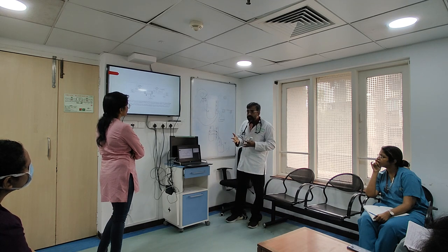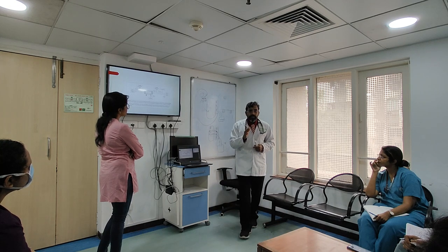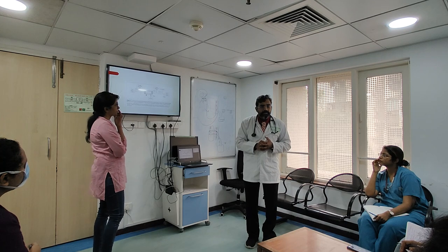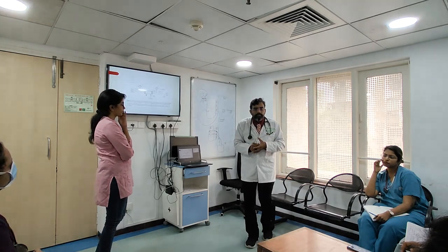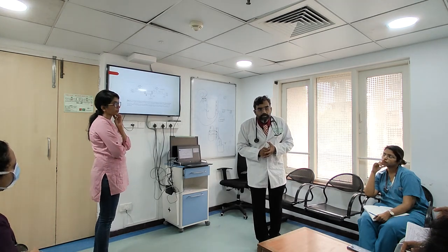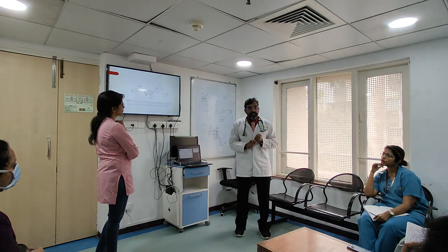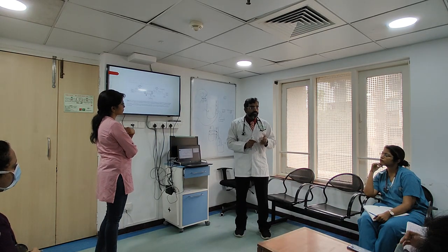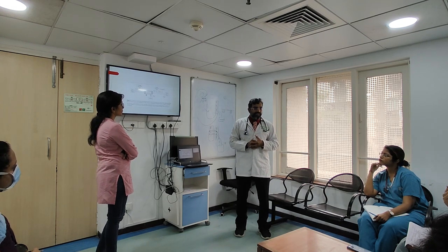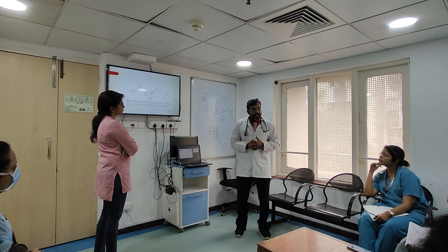Now there are certain problems with both of those. If I say pre-filter replacement, what could be the problem, Niharika? What logically do you feel could be the problem? Nikhil? More convection is happening, so there are chances of more solute and more fluid getting removed. Yes, one thing, very good. If I were to give fluid there, it can cause more convection, right? So in a modality of CVVH, it is going to cause more convection. Second, what else can it cause?